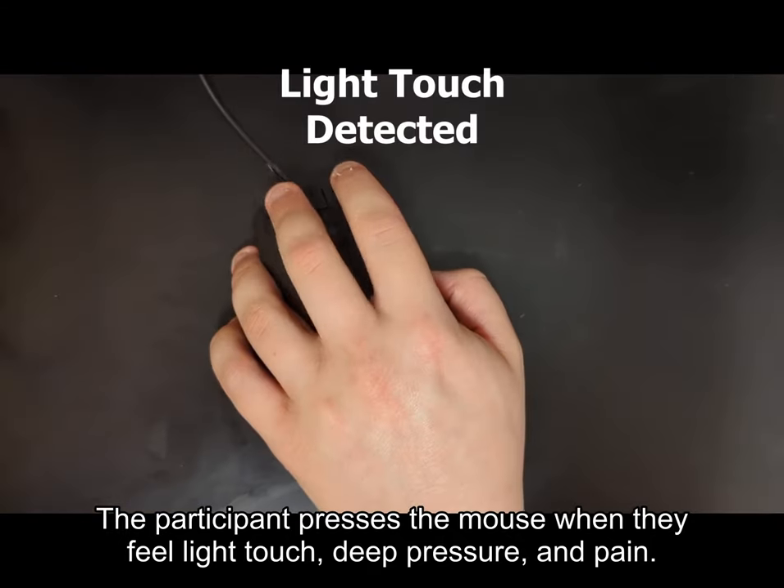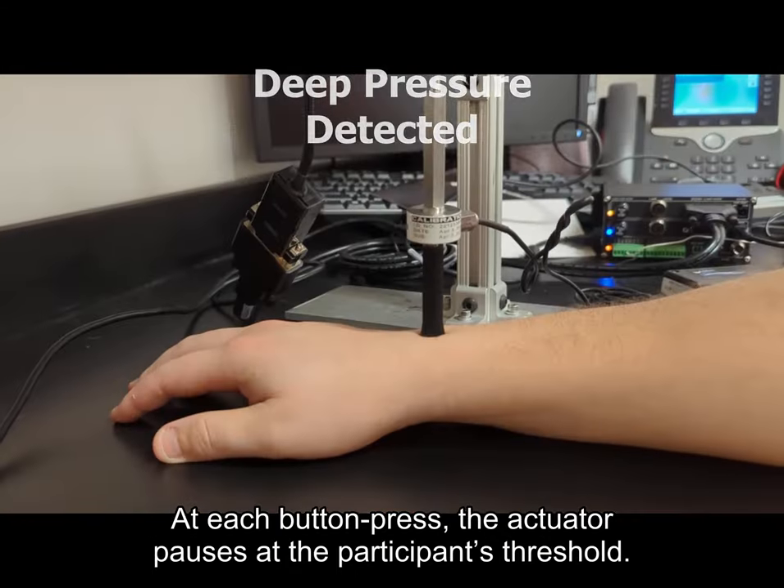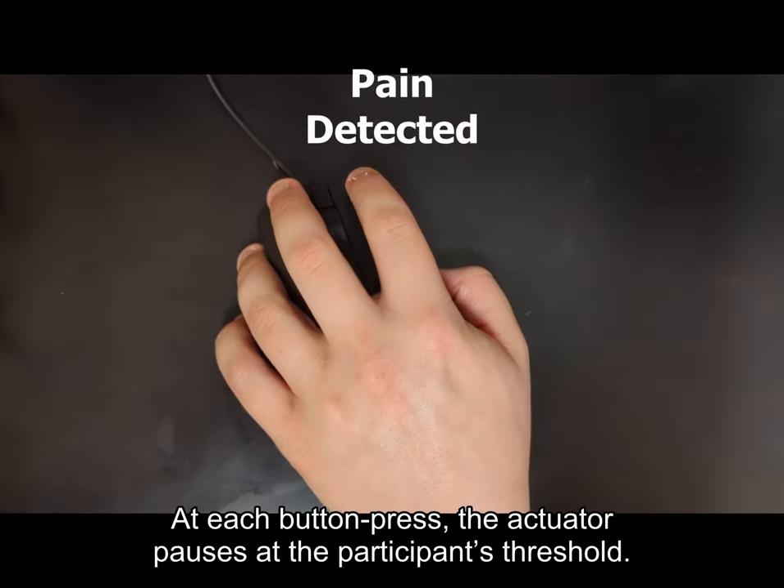The participant presses the mouse button when they feel light touch, deep pressure, and pain. At each button press, the actuator pauses at the participant's threshold.